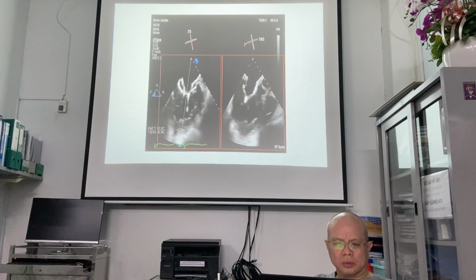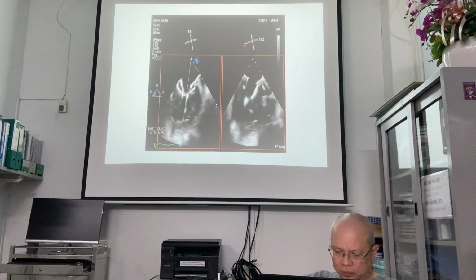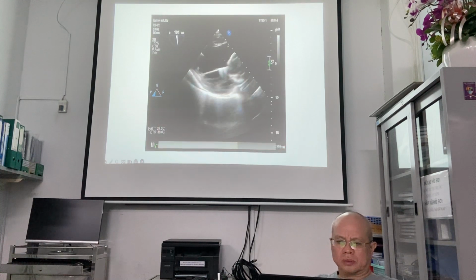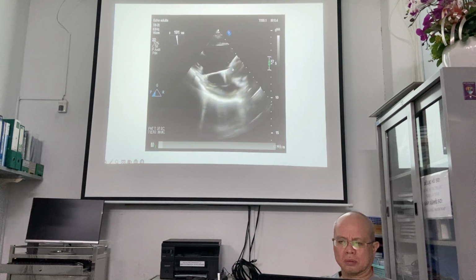It's a percutaneous valve. This is the Tendyne. I show you. We have done 3 cases of Tendyne. Tendyne is a percutaneous mitral valve. You put it through transapical, okay? And the valve is maintained by a wire. You see this here? At the apex. This is the only valve that is commercially available. Percutaneous mitral valve is a Tendyne, and we have done 3 cases.